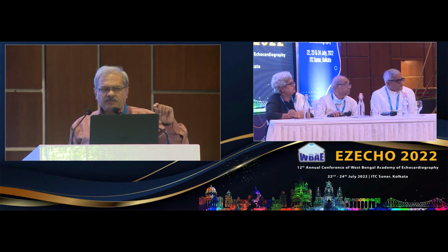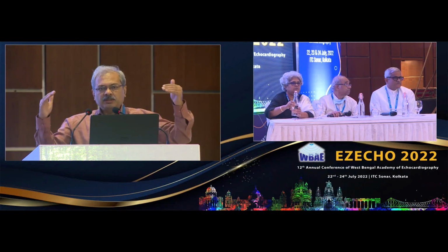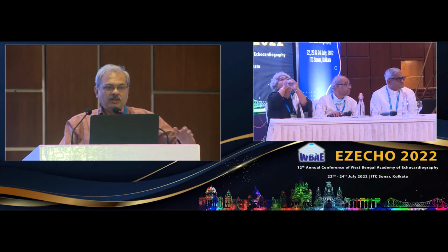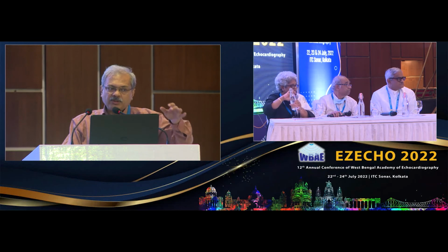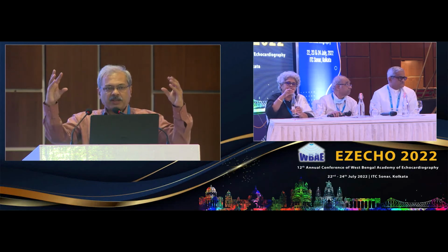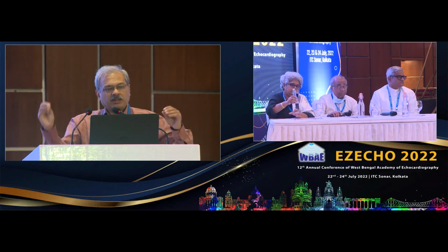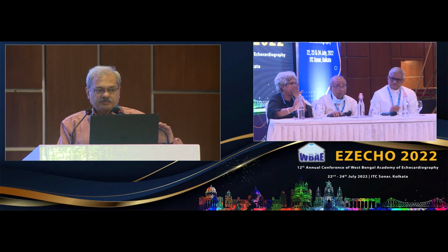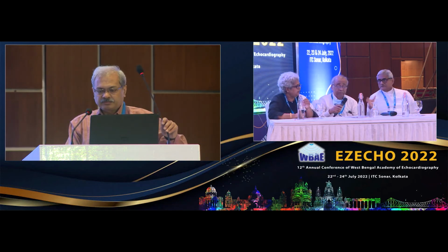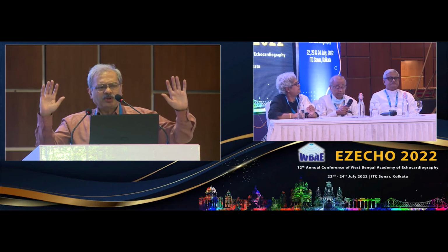So people have diagrams, but the mechanism is such that you don't release it unless you are sure. So you have to be sure with your 2D, you have to be sure with your 3D, and you have to be very sure that the clips have held the leaflet, and then only you release. So that way it has become a safer game. And you have all the time on your side.